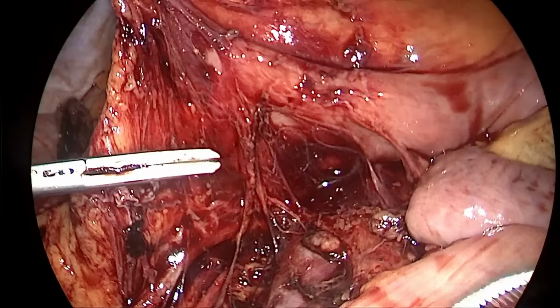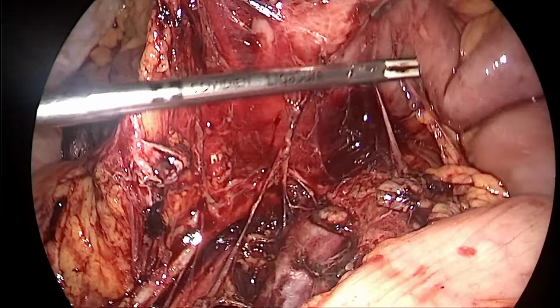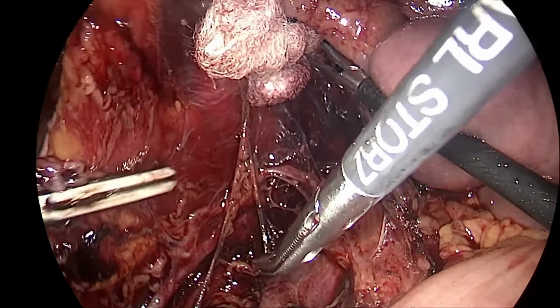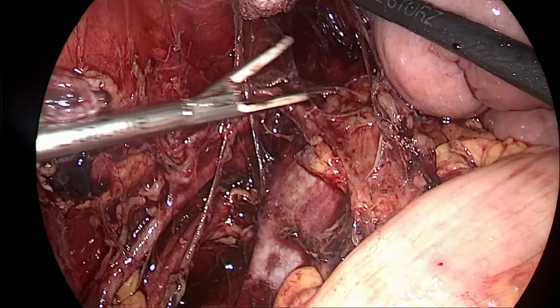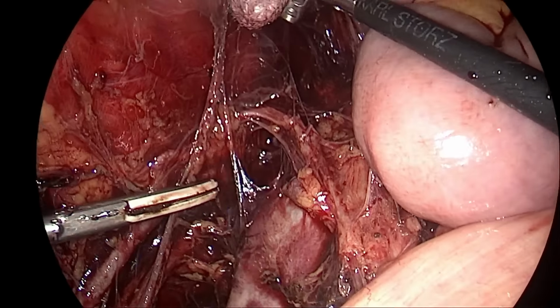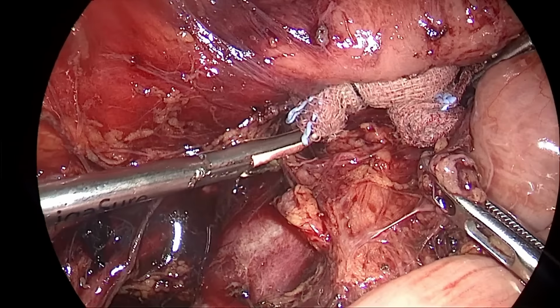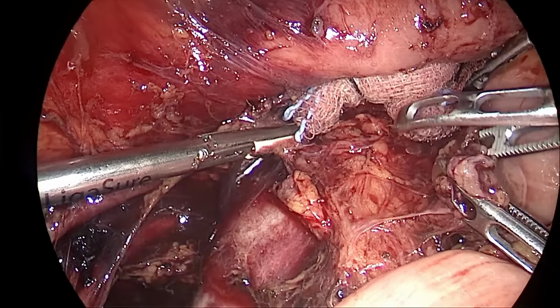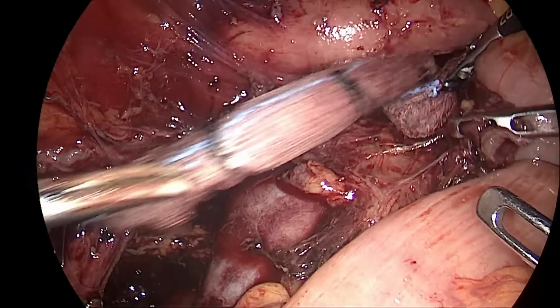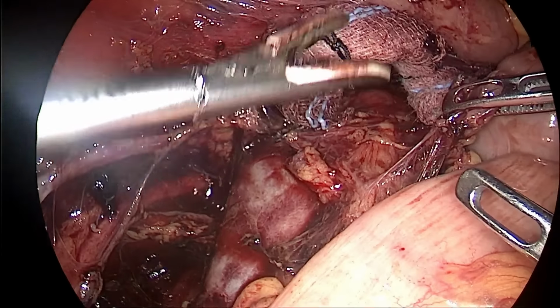Now the camera position has been shifted. Now the camera is on the suprapubic port. So that's our duodenum. So I'm pushing the duodenum up with a gauze piece. So you can identify on the right side there are the gonadal vessels, and below that lies our ureter. That's our IVC. So with the help of the gauze piece, I'm giving traction on the bowel, and on both the left and the right hand side the peritoneum has been pulled off to create this plane.